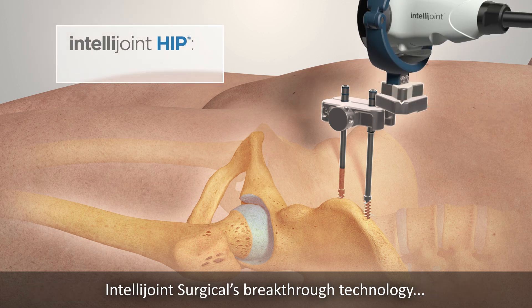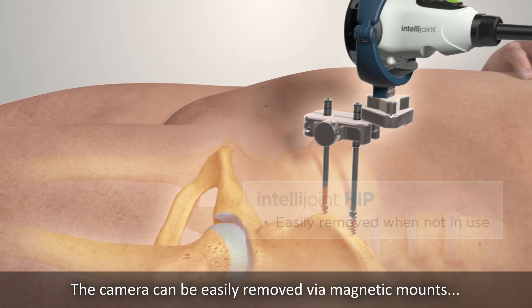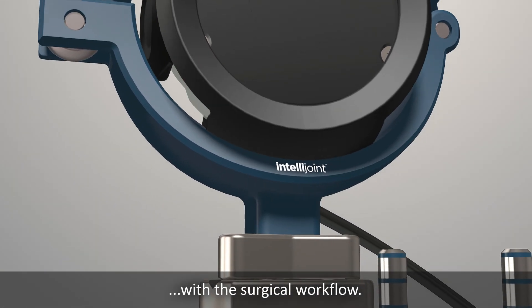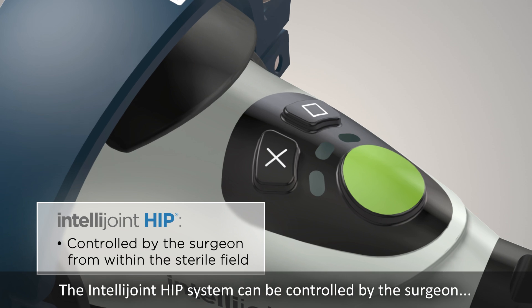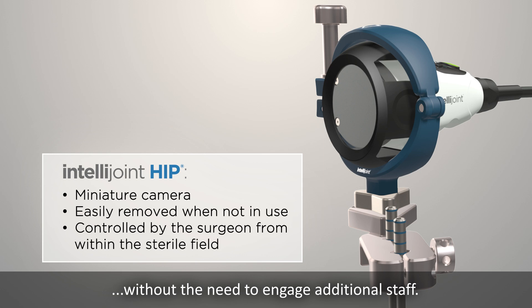IntelliJoint Surgical's breakthrough technology is encapsulated in a single miniature camera that is attached directly to the pelvis. The camera can be easily removed via magnetic mounts when not in use, to eliminate any interference with the surgical workflow. The IntelliJoint Hip System can be controlled by the surgeon using the buttons on the camera from within the sterile field, without the need to engage additional staff.